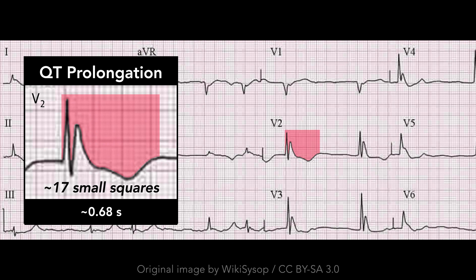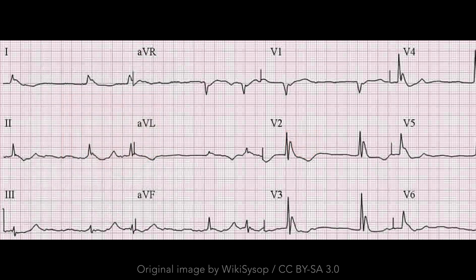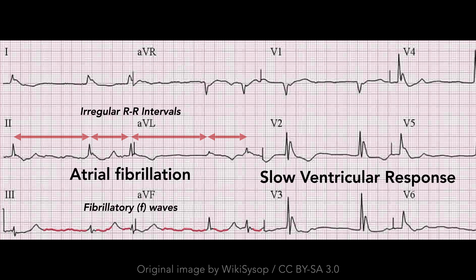The PR interval and P-waves cannot be assessed due to the underlying rhythm. In regard to the underlying rhythm, marked slowing of the heart rate can occur due to a variety of arrhythmias, such as sinus bradycardia, AV block, and atrial fibrillation with slow ventricular response. In this ECG, note the irregular RR intervals and fibrillatory waves of AFib, yet the slow ventricular rate.